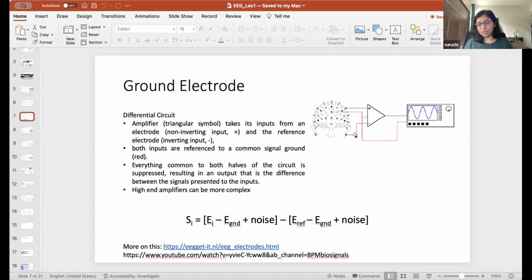It is happening, but probably it's not necessary to understand it in detail, because we are getting what we want. Ideally, if you want to think about it, it happens before you amplify the signal. So before we amplify, we do this so that what we capture already has the noise removed a little bit more. Because in both sources you will have noise: in the reference you'll have noise, and in the ith electrode you'll have noise. And we've reduced that a little by taking the differences. So it's good to know because you'll also do setups and you need to understand what your setup is like.